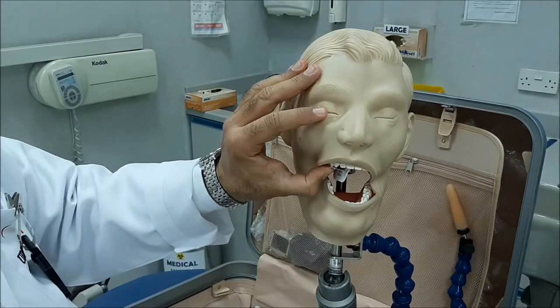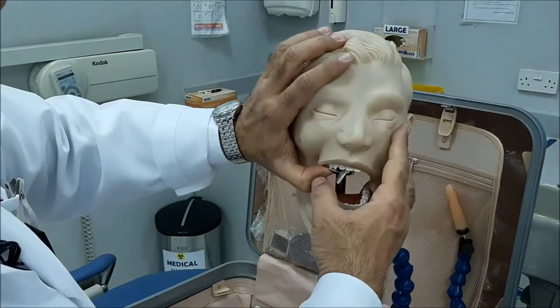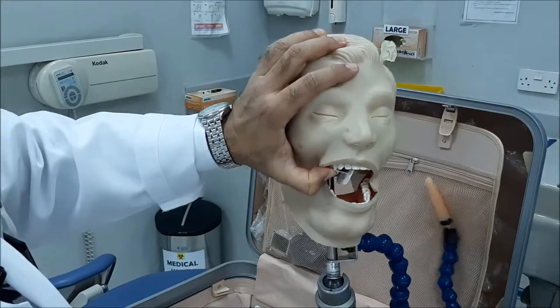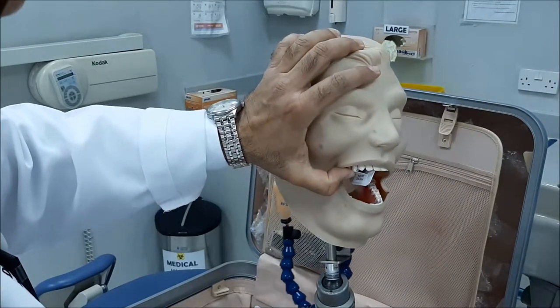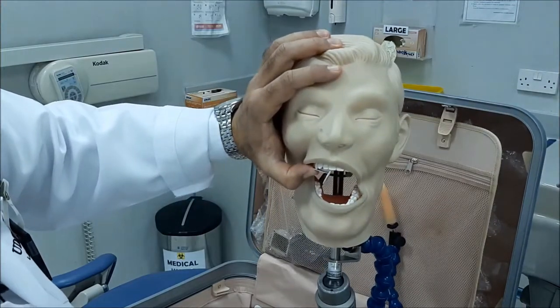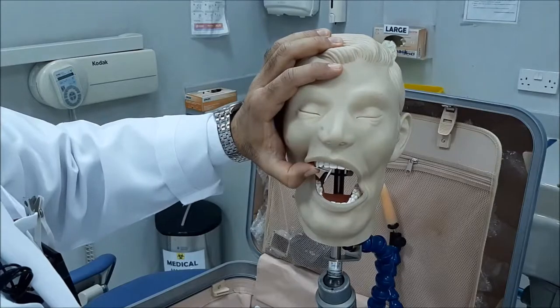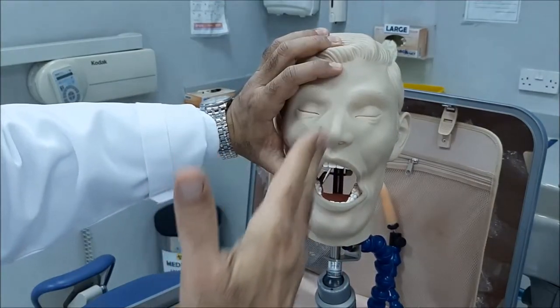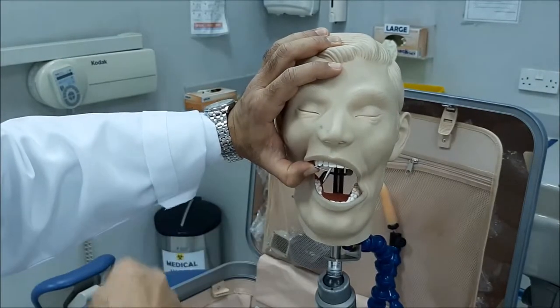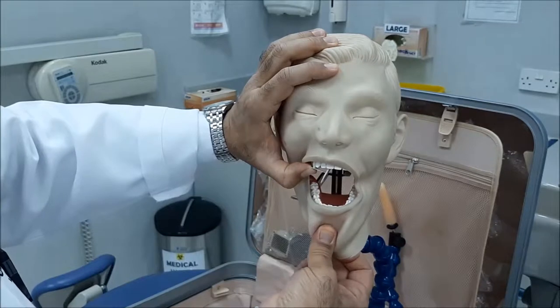So the two premolars are now in the center, and the area of coverage will be from the lateral or canine backwards to the mesial of the six. With this placed, always try to get this relationship because it will be important in directing your vertical beam or vertical direction.